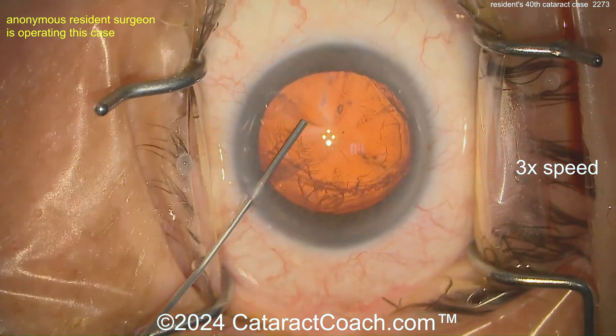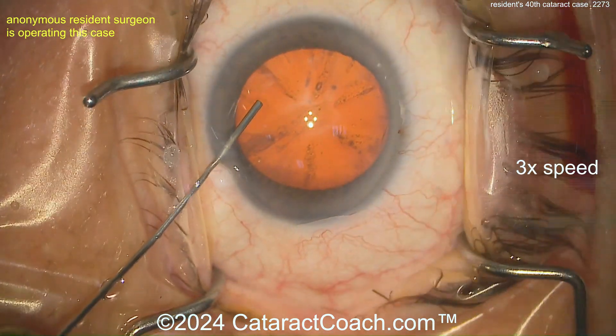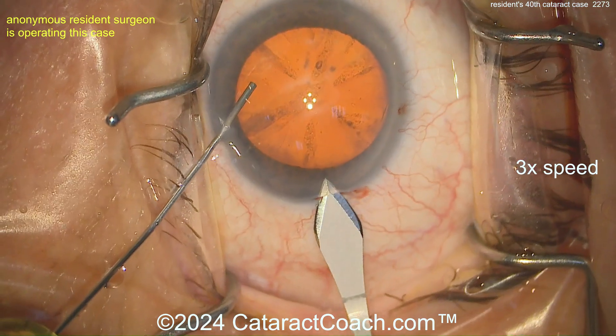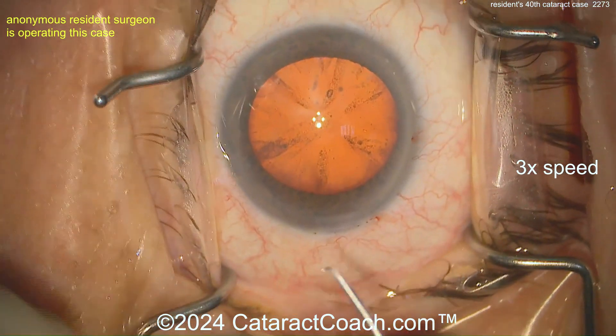First things first — that's some good draping. Eye in primary position, good draping for your 40th case. It's a pretty good incision too. I like the little groove you made at the beginning. Very nicely done.